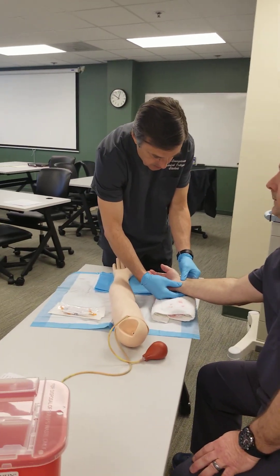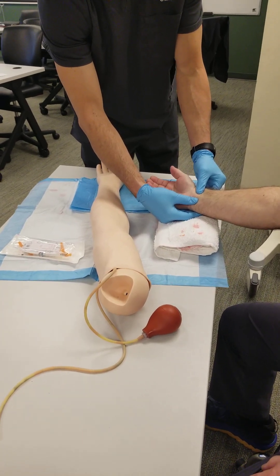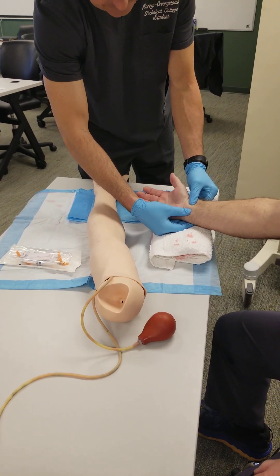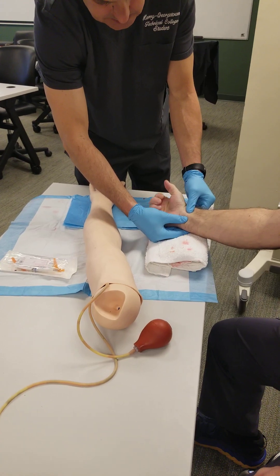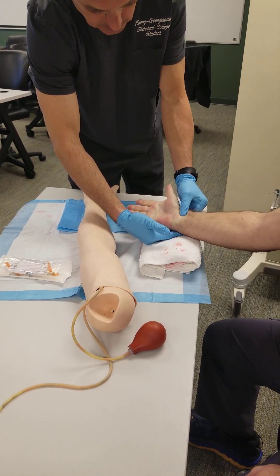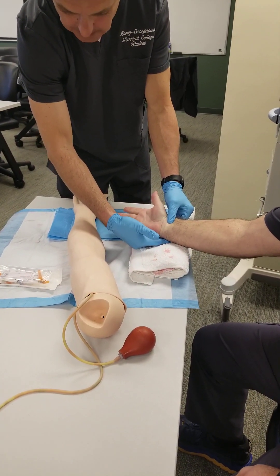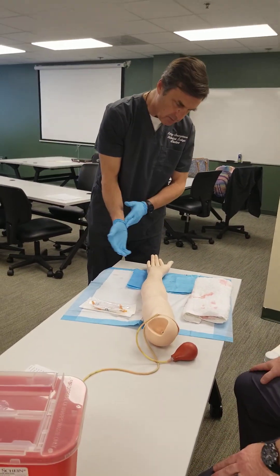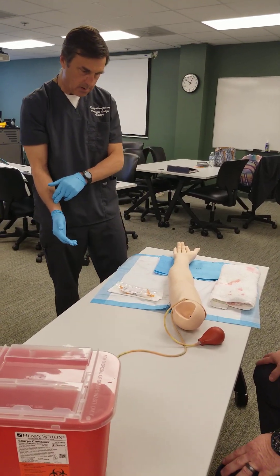I'm going to apply pressure on both your radial and ulnar arteries. Mr. Johnson, if you could make a fist, let go — make a fist, let go — make a fist, let go. Then I'm going to release his ulnar artery and see if it returns back to flush. That means he has good collateral circulation in both his radial and ulnar arteries — so in case something goes wrong with his radial artery, he'll still be getting blood through his ulnar artery.